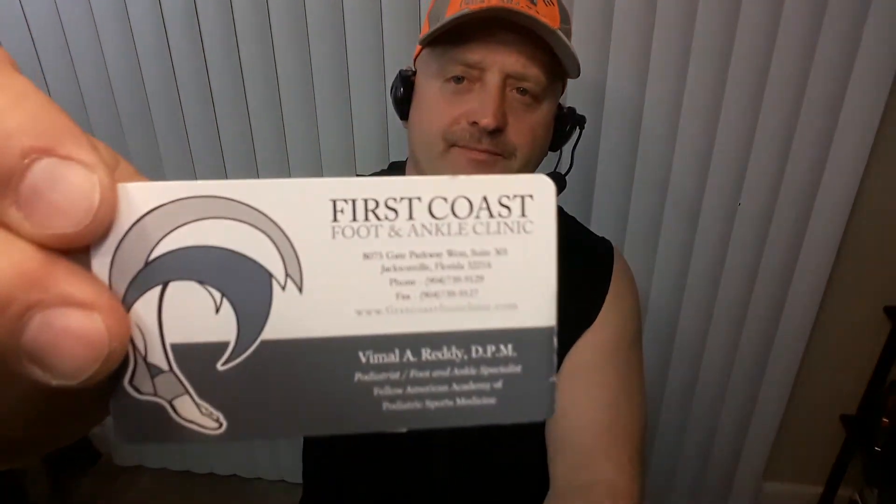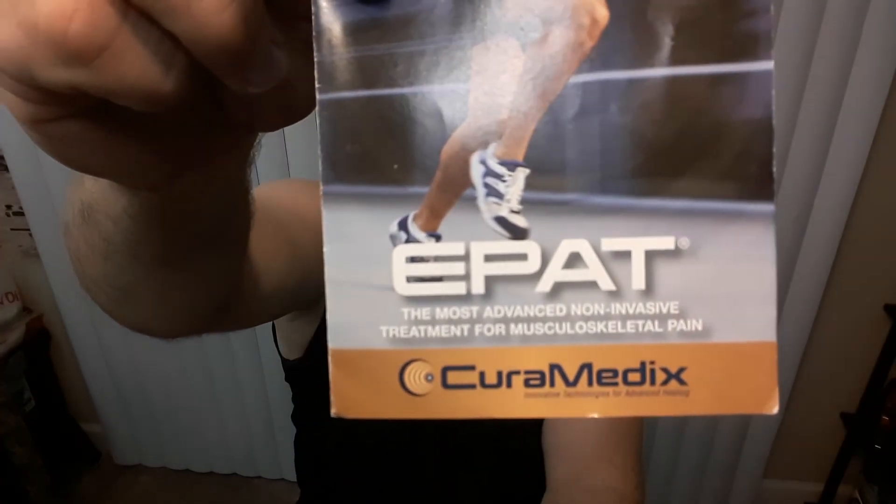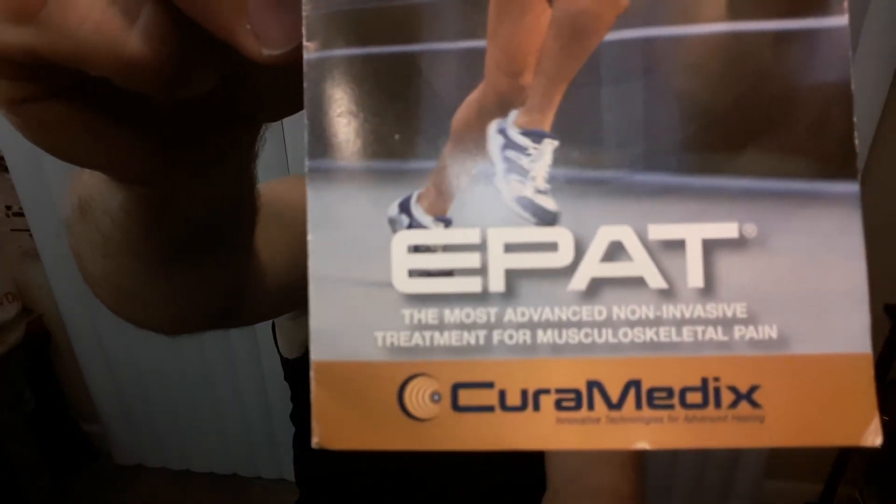Again, this is Roger with Roger's Reviews. Give a thumbs up to First Coast Foot and Ankle with Dr. Reddy and the EPAT. This is a great non-invasive way to get your movement back. What's nice is you don't have to do anything else — you just go back to work and try not to do any strenuous physical activity. You don't work out, you don't do extreme stretches, you don't do anything painful. You kind of just take it easy while you're getting the treatments.